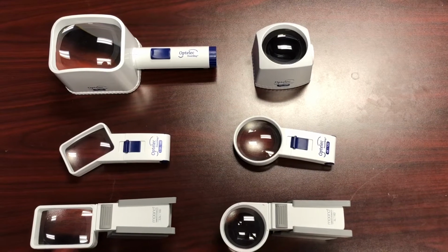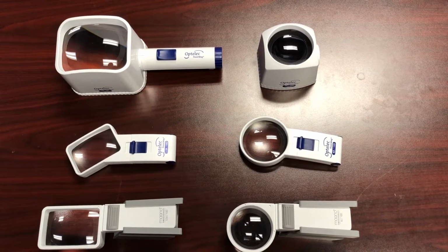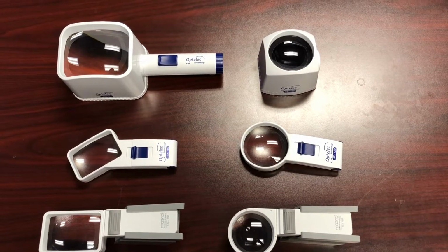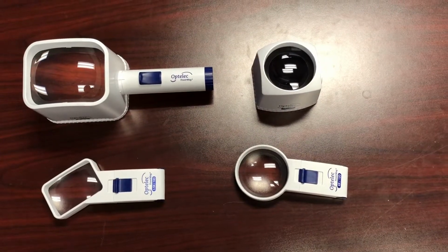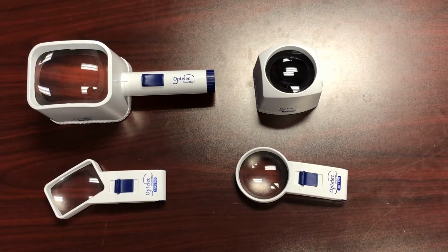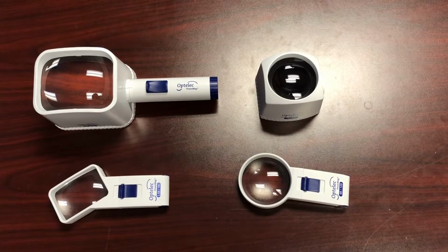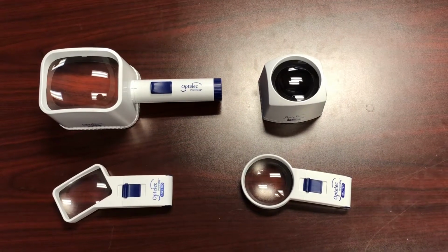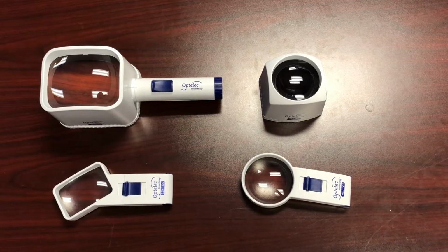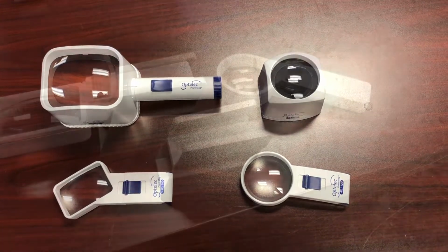For this month's How I Do It review, we're going to be comparing optical magnification, namely the Powermag versus the Magno. Powermag is a brand made by Optelec. Here we can see along the top their stand magnifiers. On the left, 3x, on the right, 4x. And below, on the left, we have the 3.5x handheld magnifier and the 4x handheld magnifier.